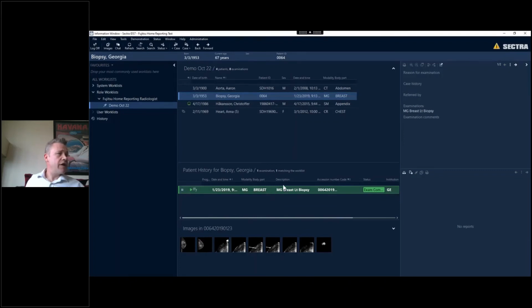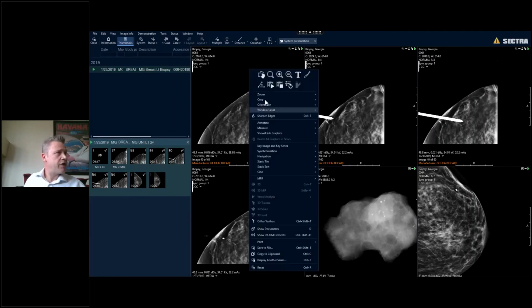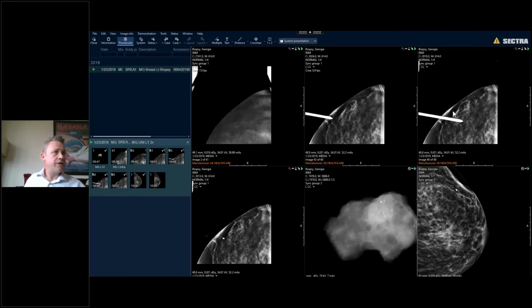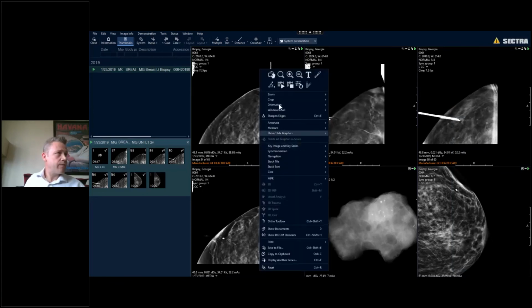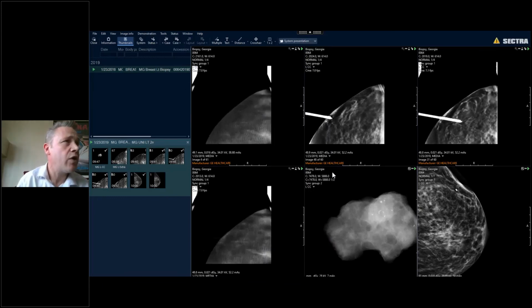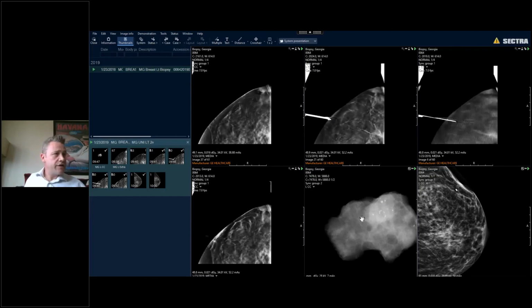What I'm going to show you is something I'll be working on next. So this is coming up. This will be at the full Quad HD 6 megapixel spec. I'm hoping to get up to 8 megapixel on the new monitors that ISO have got. But what I'm going to show you here, I'm going to start all of these sequences up. So there's 2, 3, 4 sequences running. I know you wouldn't do this normally, but I'm just showing this for effect. So you've got all 4 sequences there I can display running, and then here's the image here.